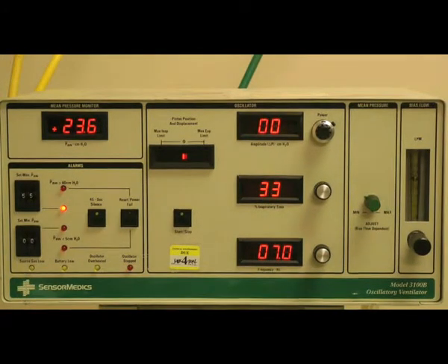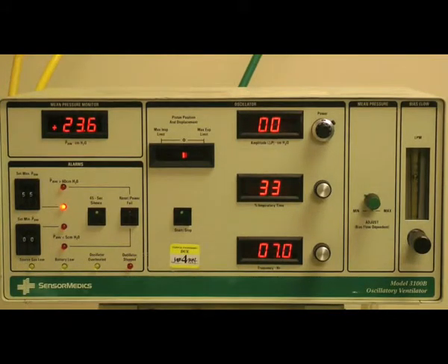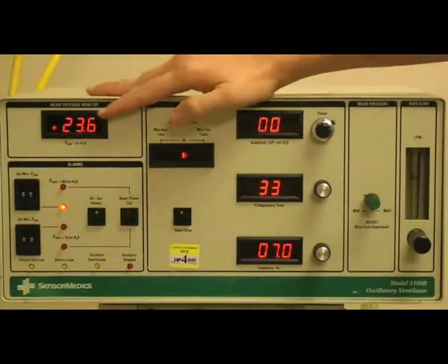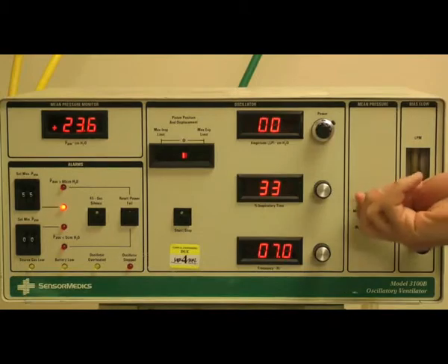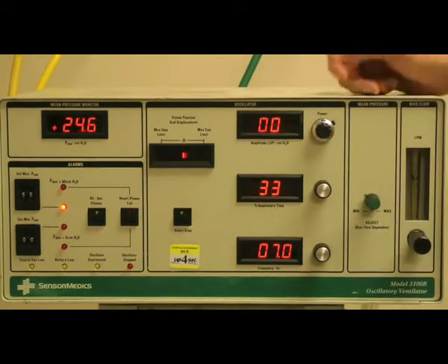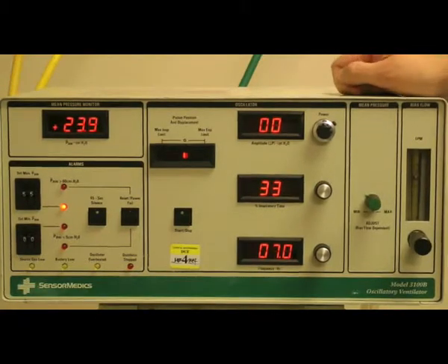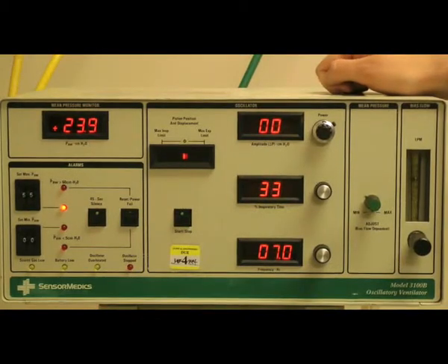For oxygenation management in a patient with ARDS on the high-frequency oscillatory ventilator, you have two main controls. You have your FiO2 and you have your mean airway pressure. The FiO2 is mainly adjusted by your oxygen blender, which is found on the lower portion of the oscillator, but is also affected by your mean airway pressure, again with the knob to the right. Increasing clockwise will increase your mean airway pressure and vice versa. It is also important to remember that in order to monitor the FiO2, you will need an oxygen analyzer in line with the circuit and the flow meter that is attached to the blender.